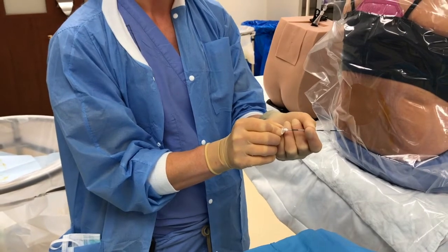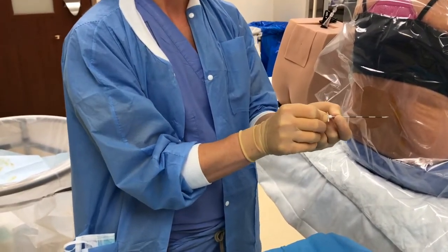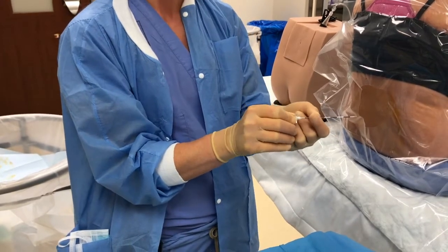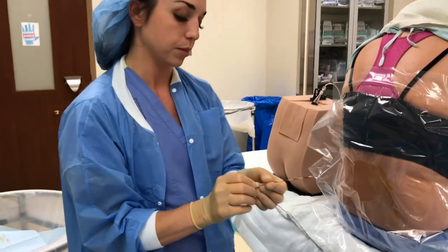If you have a very skinny parturient like Emily, and you're already at 8-9 centimeters, you might want to double check with the stylet to make sure that you have not crossed into the CSF space.